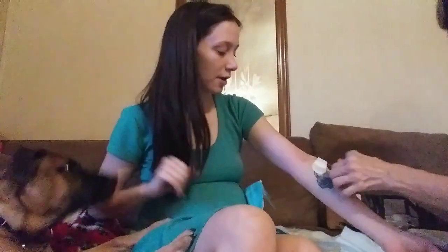Let's leave it — let's make sure it's going to flow well. I'm just going to put that here. They sent me a whole bunch of Koban too because I did my order and I told them I needed extra of like all of these supplies. So they sent me a small box packed full of all the small stuff, and I've got like five things of Koban now. I told them — I think one of the last times we went through an entire roll of Koban in one visit because the veins weren't holding and I kept blowing out and we had to keep wrapping gauze around. Can you send extra please? And so she sent like five things of Koban. I probably won't need that for a while, I hope.